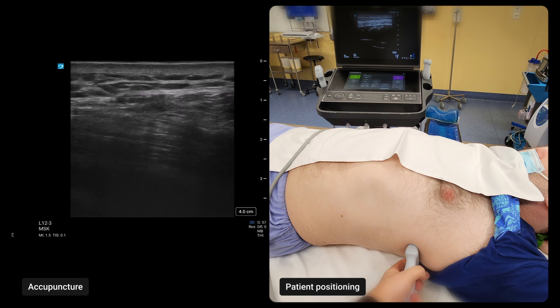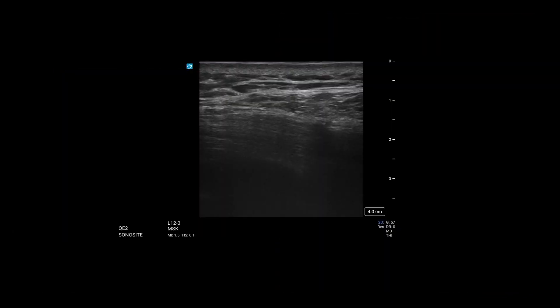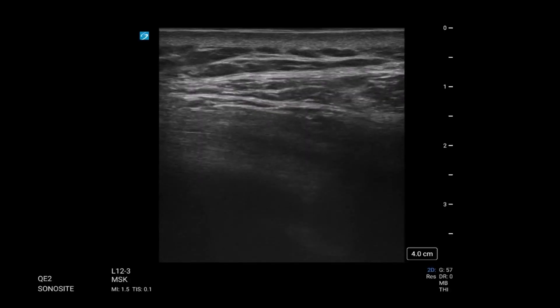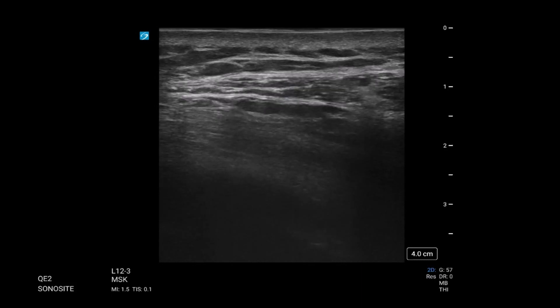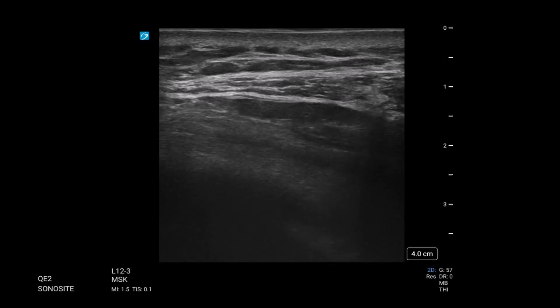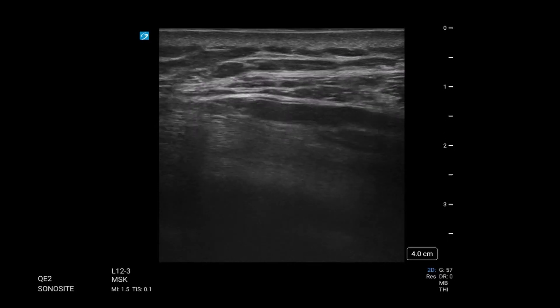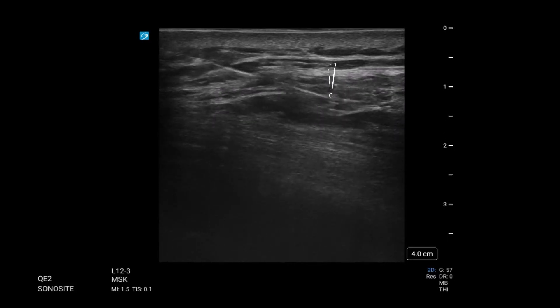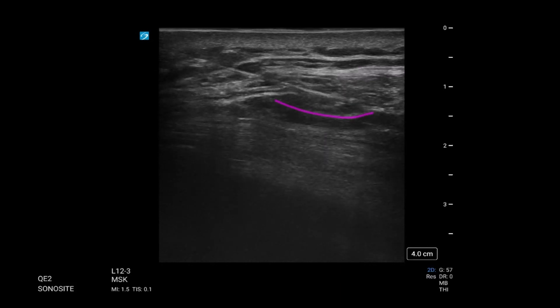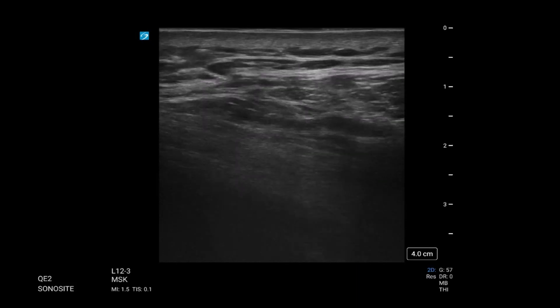Needle visualisation could be better — that's alright. We'll use a bit of hydrolocation to help. A little bit of movement there — this looks like it could be the right spot. We're doing a gentle injection. We can see we're too low — we're in muscle. Pull back the needle and you can see it really opening up and unzippering. Even though we've got poor needle visualisation, that doesn't matter — we know where our vessels are and we've got really good spread. Quite often I'll just leave it there and open that pocket up, then go hunting for the needle.